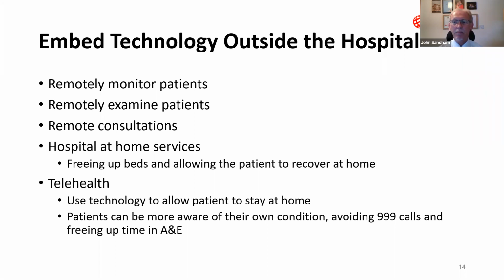One area that has been particularly important during this COVID pandemic is remote consultations with patients, thereby avoiding infection risk. Remotely operating medical services can be expanded further to allow remotely monitoring of patients, freeing up of beds, and avoiding cross-infection. Telehealth also reduces the number of emergency ambulance calls because the patient's vital signs can be seen by both the patient, allowing them to feel reassured and probably not dial 999, and the doctor, allowing them to make improved immediate clinical judgments. This could also mean that the patient gets sent an ambulance rather than calling one and gets into hospitals sooner and so able to recover more quickly.